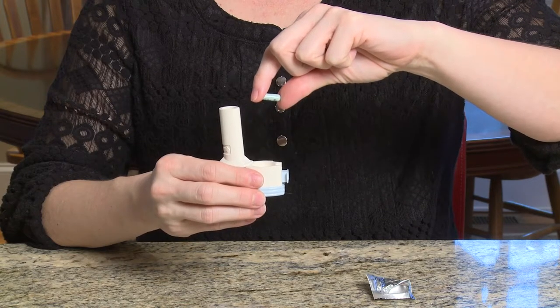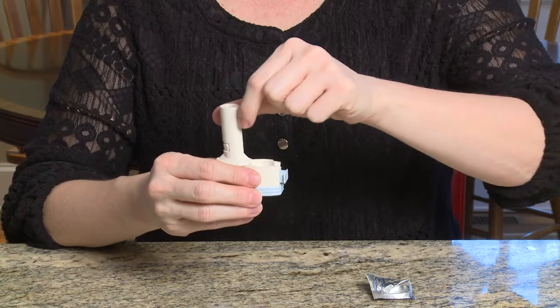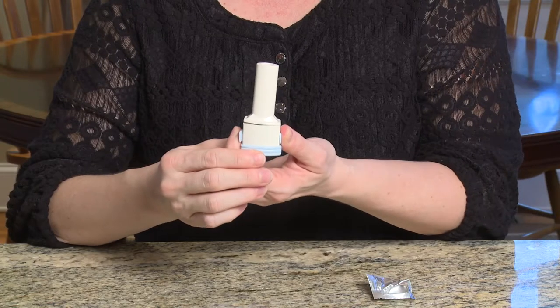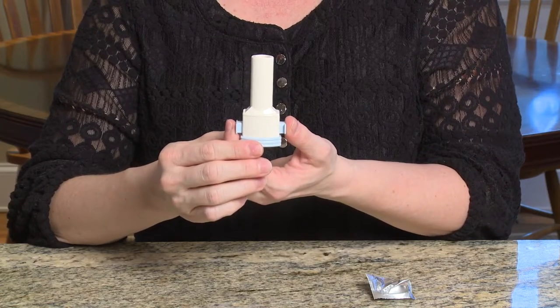It doesn't matter which way the capsule is dropped into the chamber. Close the mouthpiece firmly until you hear a click. When the mouthpiece is closed, press the piercing buttons at the same time. You only need to press once. This will put holes into the capsule so that you can breathe in the medicine.